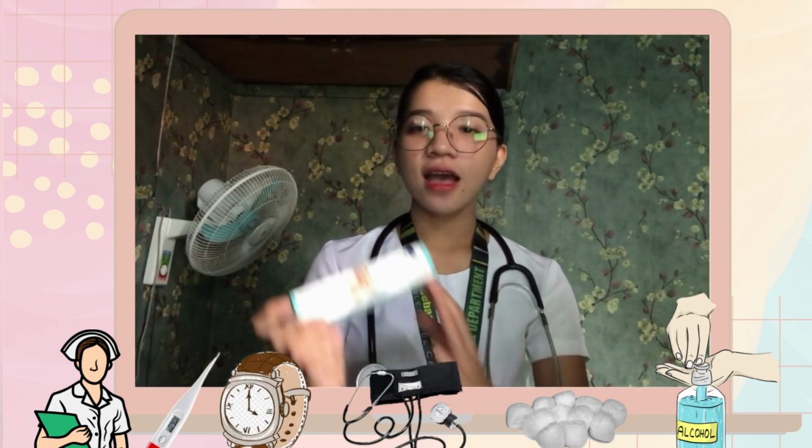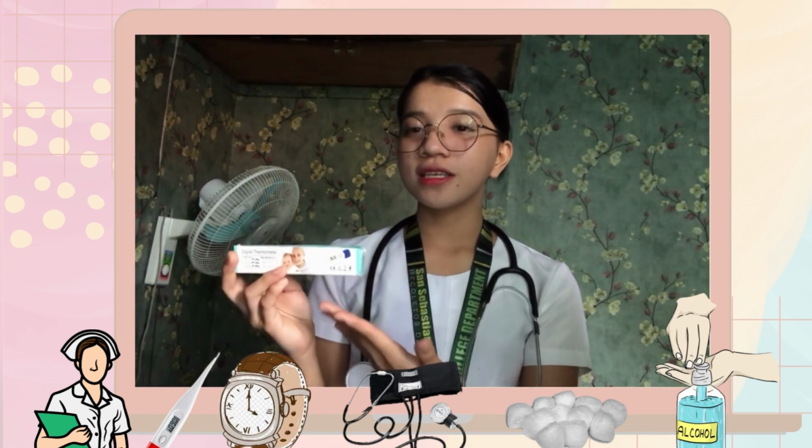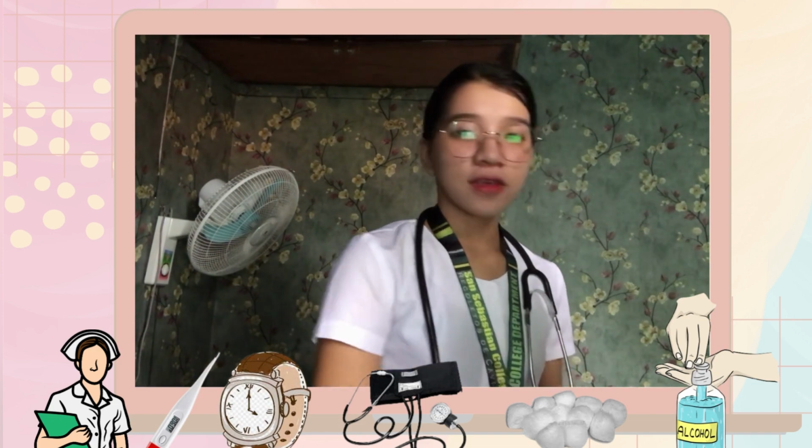The first one is the digital axillary thermometer, which is used to measure the body temperature. The next is the sphygmomanometer and also a stethoscope, which are used to measure the patient's blood pressure.